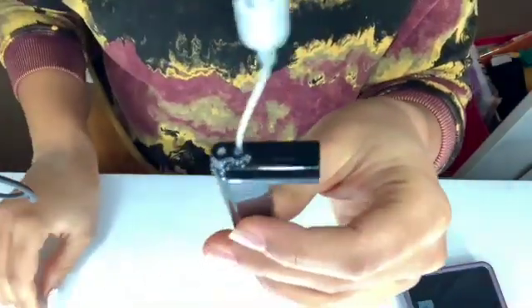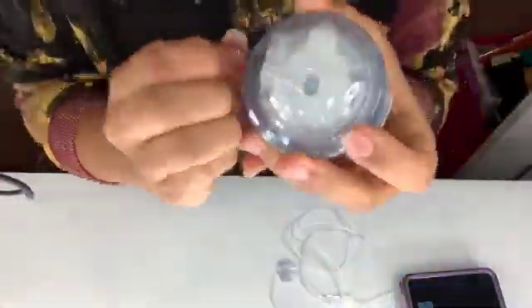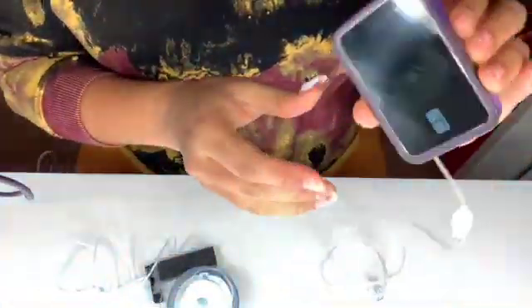And now the cartridge is full. So what we're going to do now is make sure you recap your syringe, and then we're going to open the inset, take the plastic off, and we're going to get this little tubey thing right here, untwist the whole thing, and then we're going to plug the tubes in together. Or twist the tubes in together, and that cartridge is ready to go in.